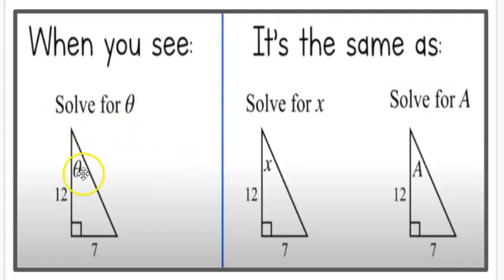And we talked about theta. This is theta, and theta is just a symbol. Could be X, could be A. And what's interesting to know, I think I looked up, theta is the 8th letter of the Greek alphabet and was considered the symbol of death at one time during the Greco-Roman days.